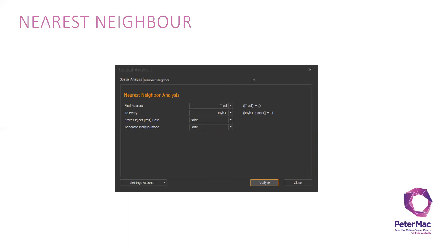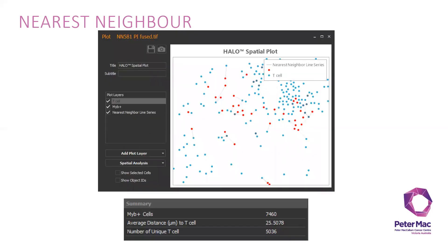Also, it'll have this spatial plot here which you can show in presentations. In summary, it will show you how many MIB-positive cells across the tissue, the average distance of MIB-positive cells, and the number of unique T cells to each MIB-positive cell.